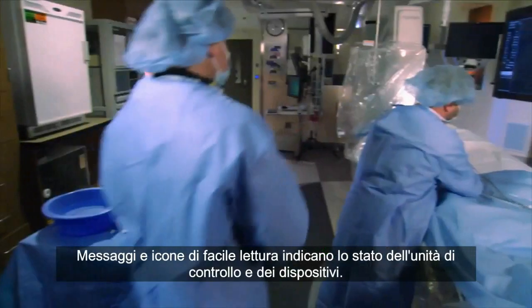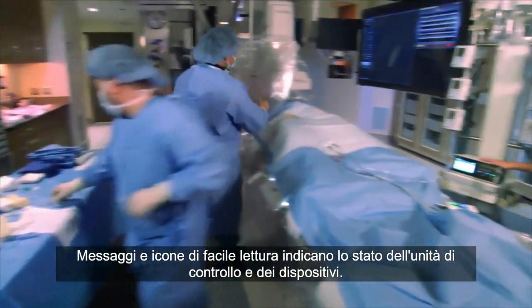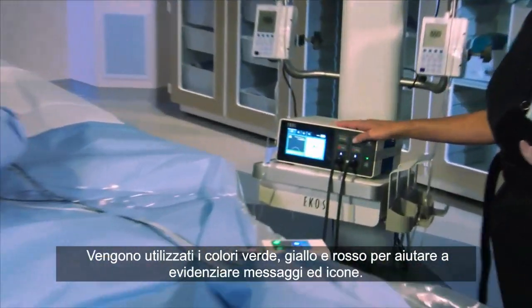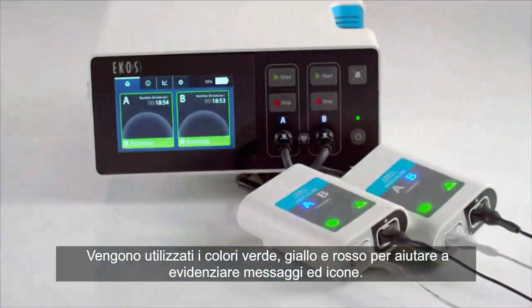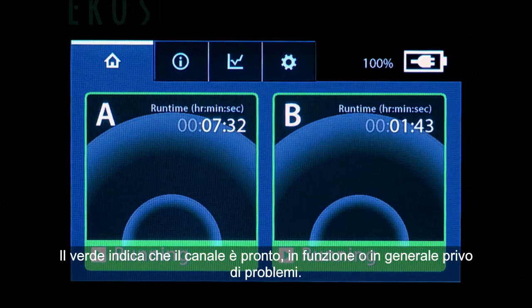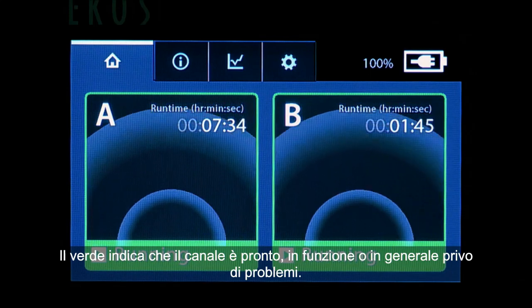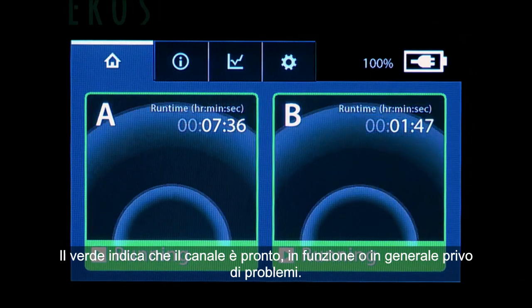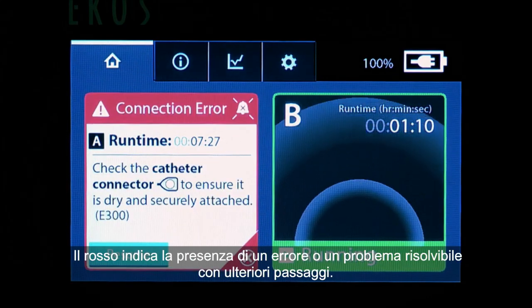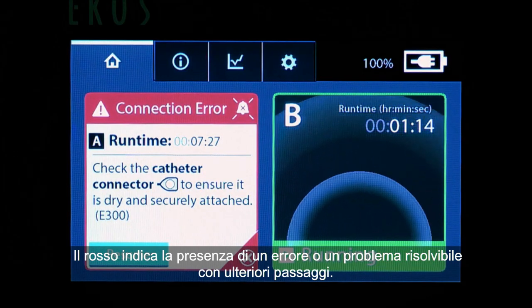Control Unit 4.0's improvements in ease of use support your team by making workflow easier, more integrated, and less stressful. Easy-to-read messages and icons are displayed to indicate the state of the control unit and devices. Green, yellow, and red color coding is used to help communicate the importance of these messages and icons. Green indicates the channel is ready, running, or generally without issue. Yellow indicates further steps are required to start the ultrasound. Red indicates there is an error or issue that requires further steps to resolve.